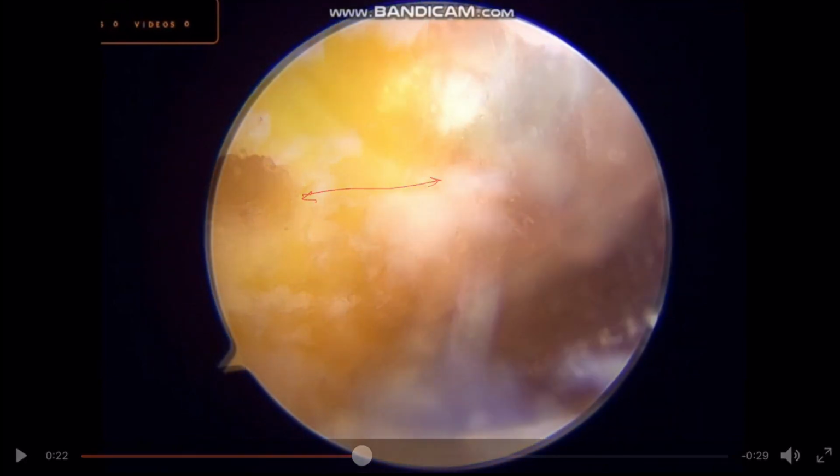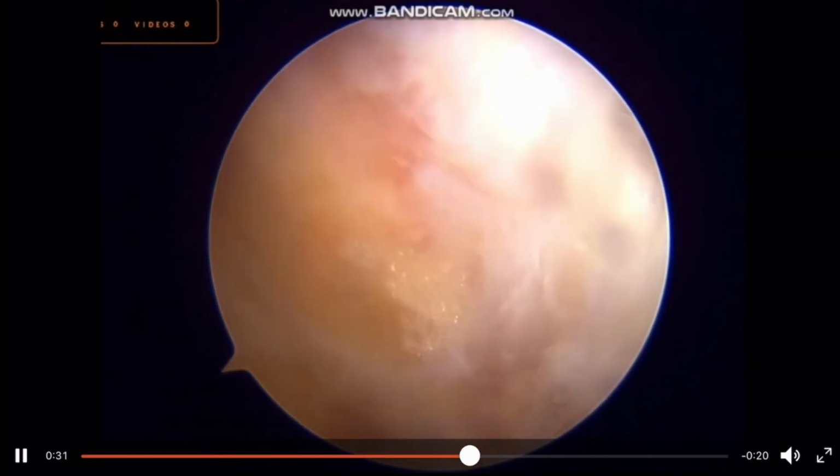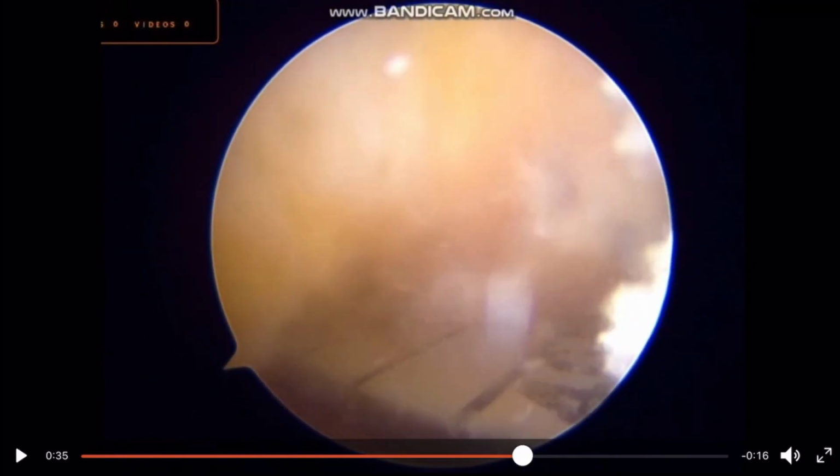then proceed. Here I am back and I have started drilling with the guide wire over that marking, and over that I drilled with 4.5 mm drill bit. Now a hole is made with that 4.5 mm drill bit as shown. Now I am seeing the depth, and the depth is around 35 mm.